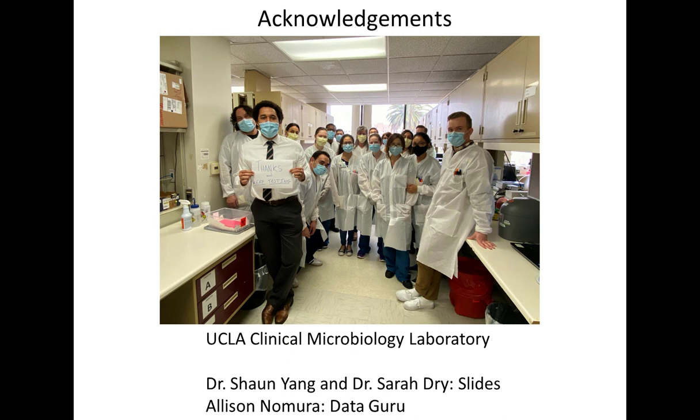And do you see value in identifying or measuring IgM response and IgG response with serology testing as opposed to just a total measurement value? Yeah, that is also a question that I don't think we have enough data on. So most of the tests that are available now are either total or IgG. Total meaning any antibody that's there, mostly IgG and IgM, and just IgG.